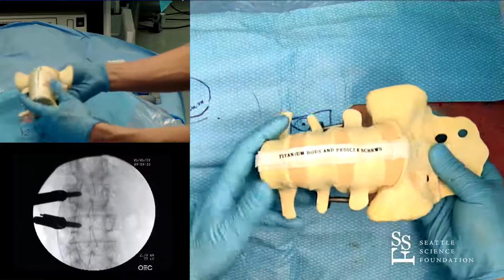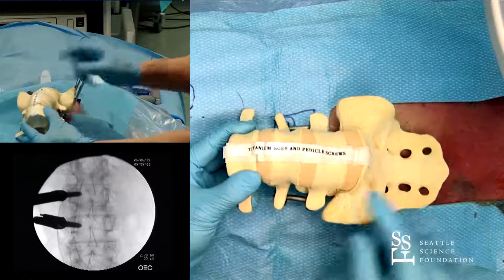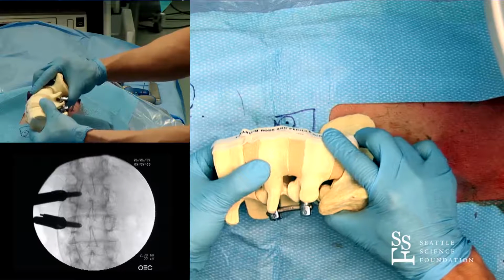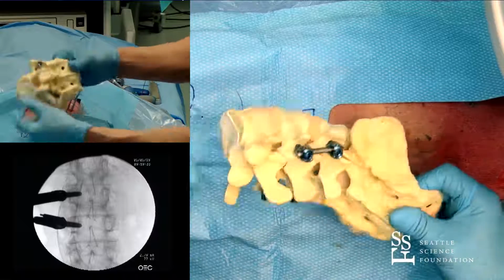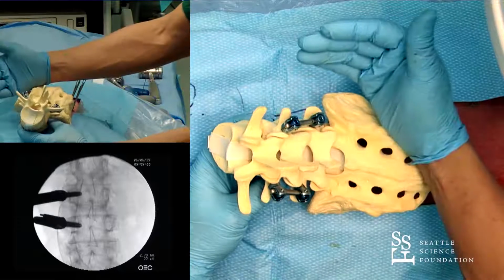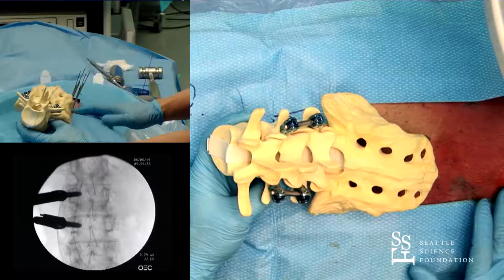So let's look at the other side. Do you see how the segment above and the segment below move? But this is the segment that has the screws. And this is rigidly fixed, right? This segment in the middle is not moving. And that is basically a spine fusion, okay? And the idea is how do we make this construct? It's a little bit of building a ship in the bottle without disrupting all the tissues, but just putting this in place without making the incision. And that's why we do it this way.